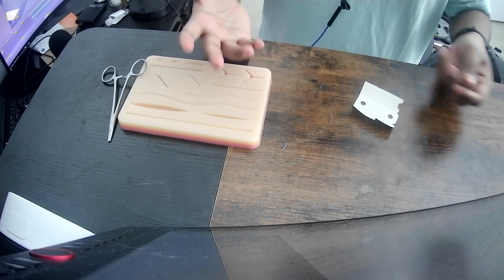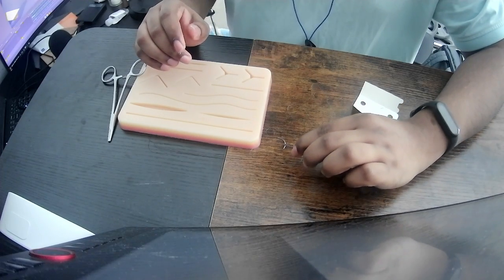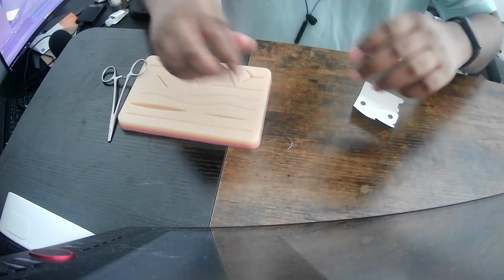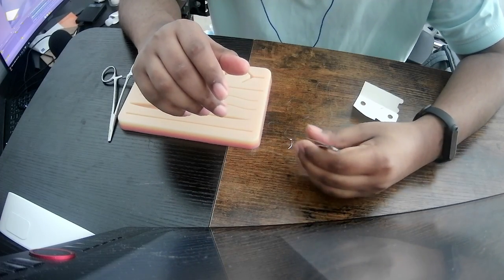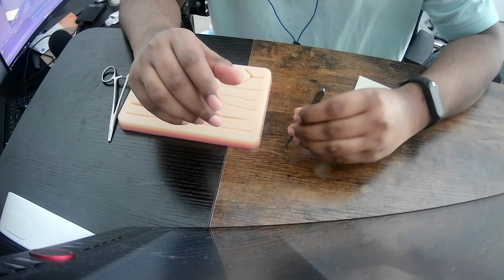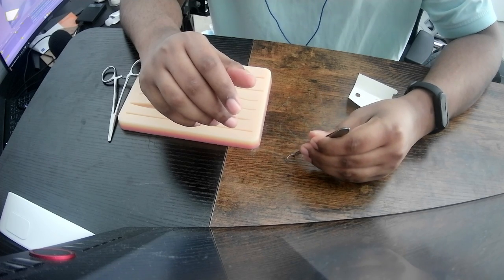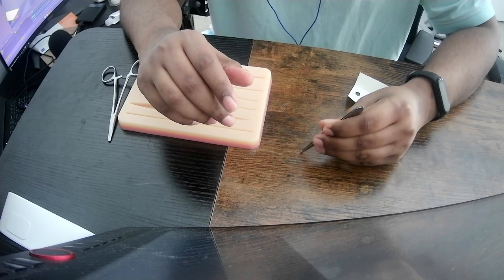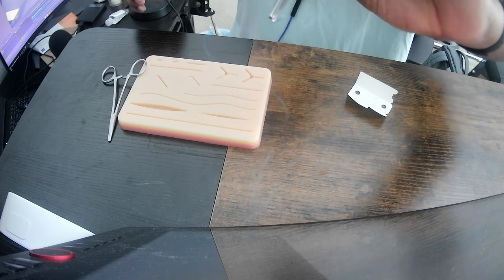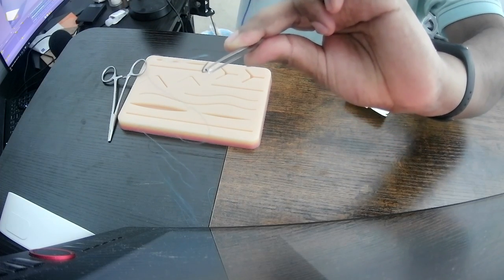And again, see, it's not secure. I'm not able to hold it very securely. That's dangerous. So it's very interesting. I thought it'd be much easier. It looks much easier on the videos. But like I said, you're trying to essentially use little tweezers to pick up a tiny flat needle. Not very intuitive. I guess that's a good way to grip it. And I hate my camera, its focus is terrible. What's it even focusing on?